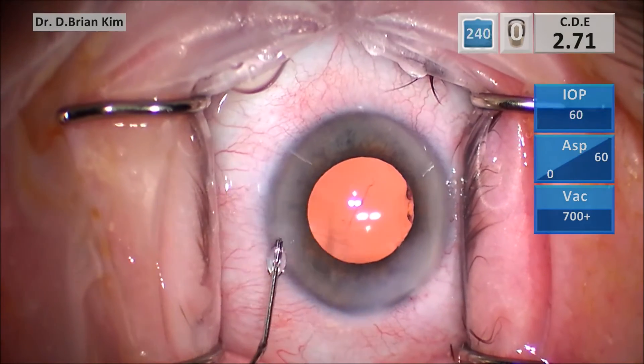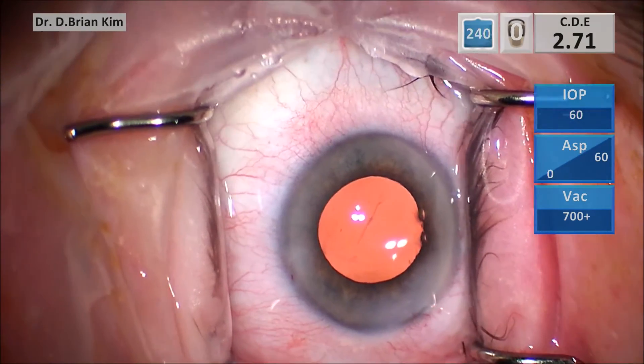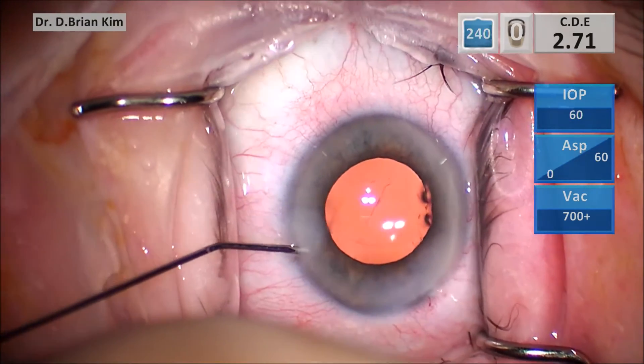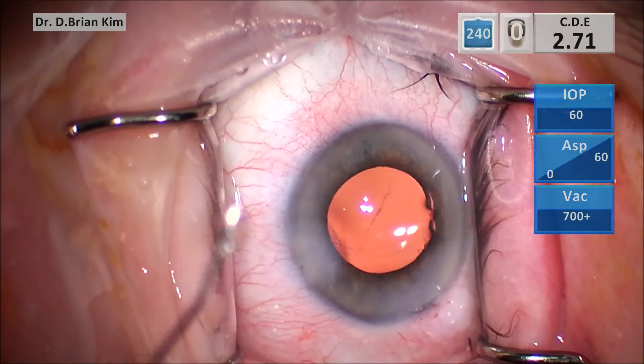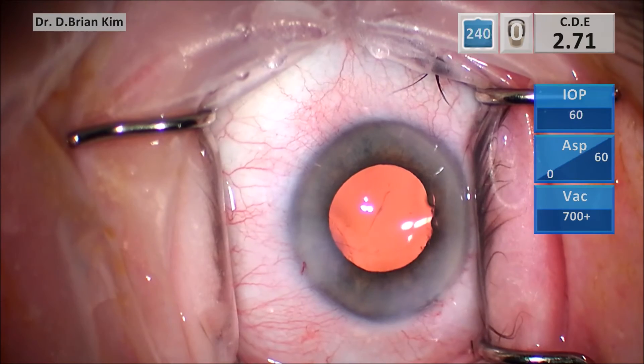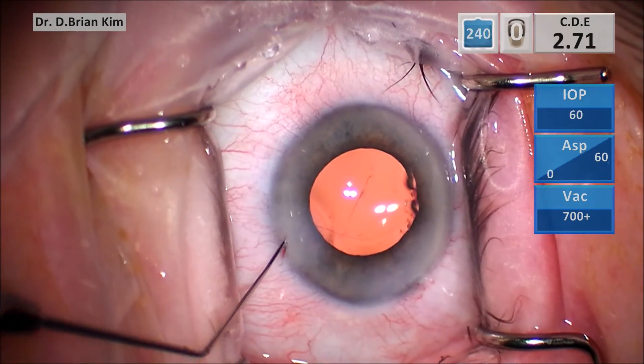Make sure you don't over-inflate the anterior chamber, otherwise the optic will just prolapse back into the bag. I chose a plus 0.50 to get an emmetropic result. In both of these patients, when I targeted that, they ended up with a very good refractive result.